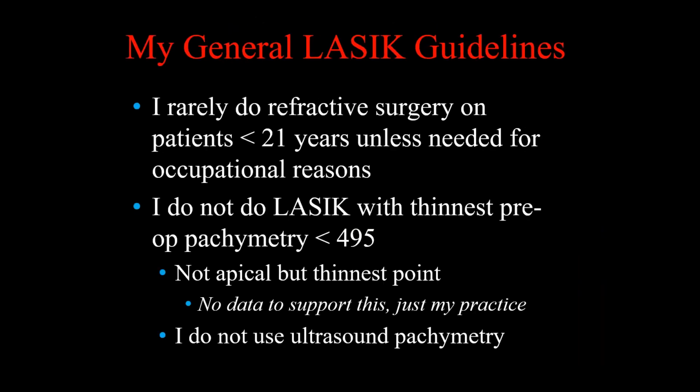People ask me, so I'm going to put this in what my general guidelines are. I'm going to end with a kind of a new thing on the BAD display. And what I do in practice sometimes is not validated by data. It's just what my practice is. But I rarely do refractive surgery on patients less than 21 unless it's needed for occupational needs. Very different outside the US, where it's very common to do refractive surgery on younger patients.